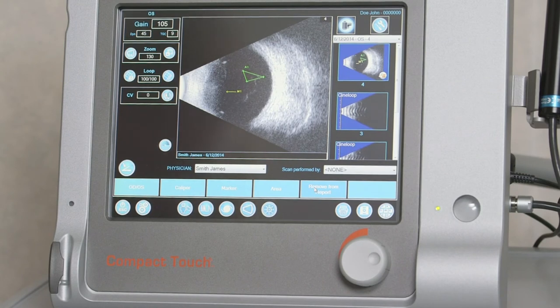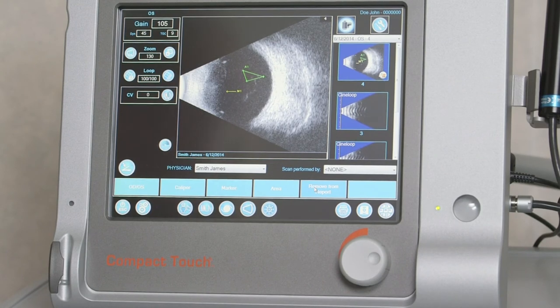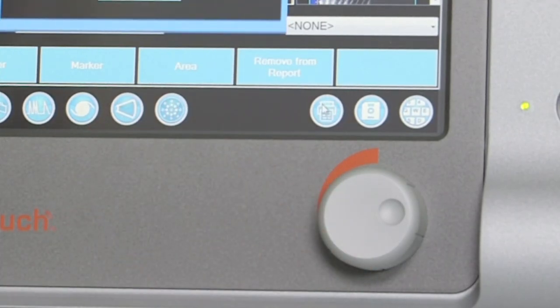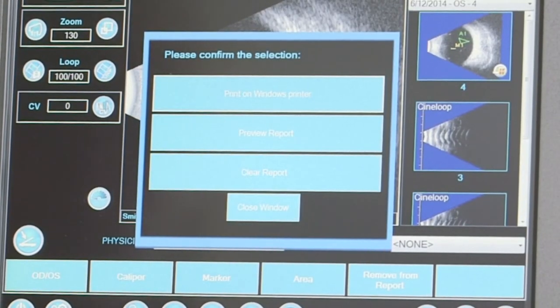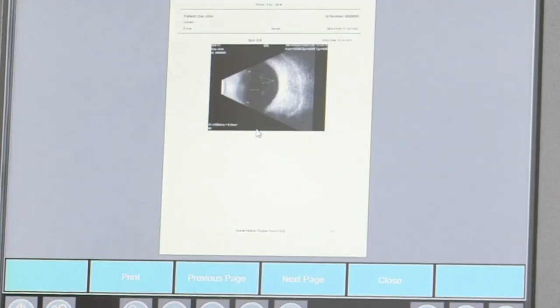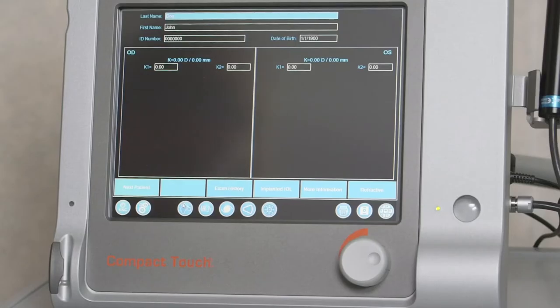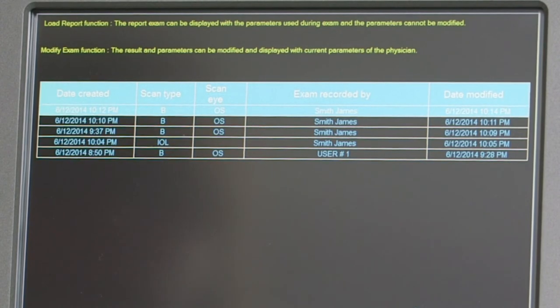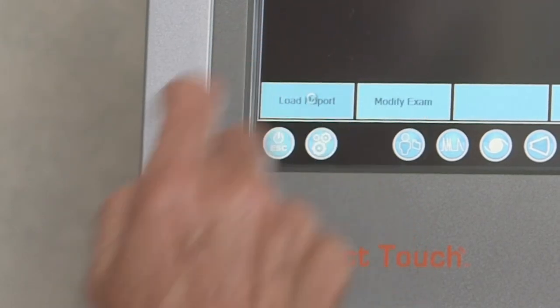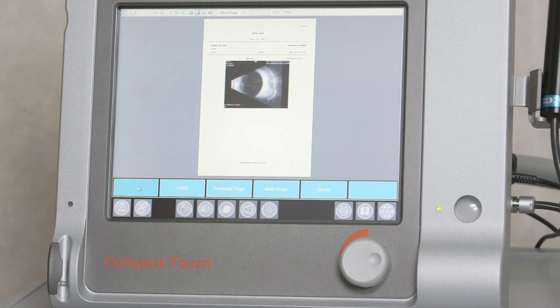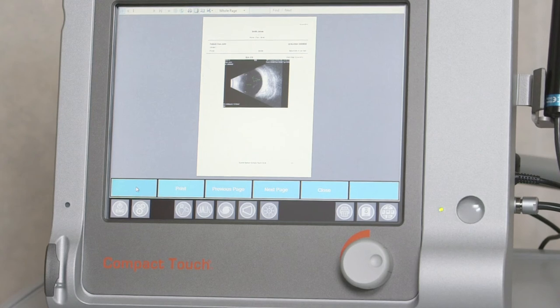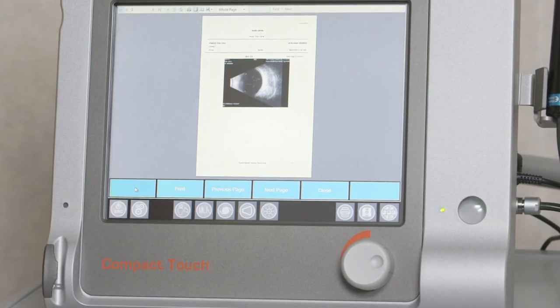Reports from A and B scans, pachymetry, or IOL calculations can be printed via the printer icon from the bottom toolbar using a video printer or a Windows printer. From this menu, the examiner can also opt to preview the report by selecting preview report. The examiner can review previous exams from the patient file screen. Choosing exam history from the toolbar displays a list of all previous exams. After selecting the exam to review or print, press load report to display the report. With the key features of the compact touch hardware and software in mind after this initial review, we will now turn to the top five most frequently asked questions about this device.